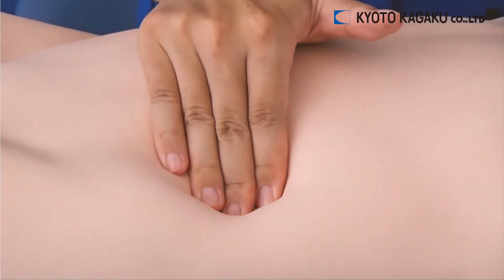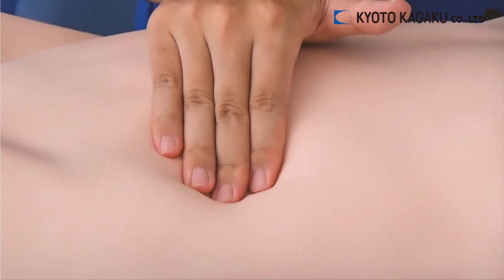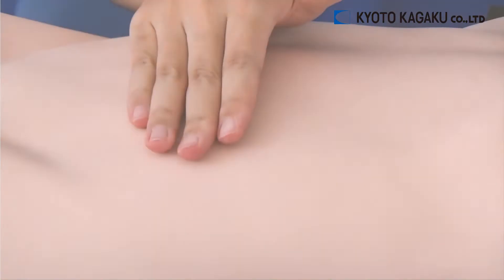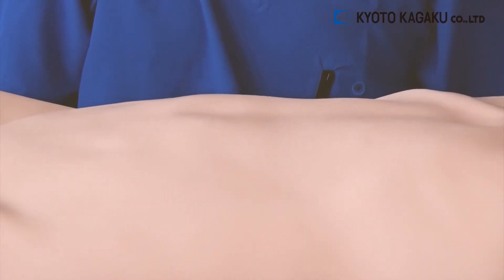This Abdominal Examination Simulator uses a new material which has a soft feel that is almost consistent with the human body. By stepping on the air pump, one can reproduce abdominal breathing.